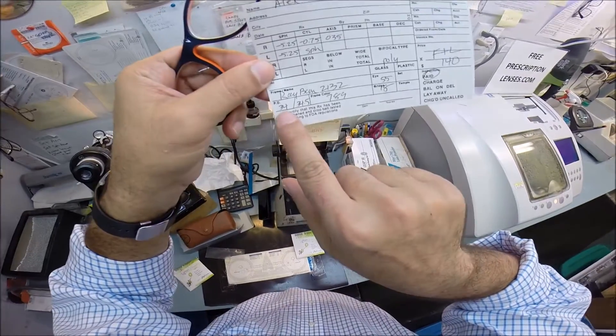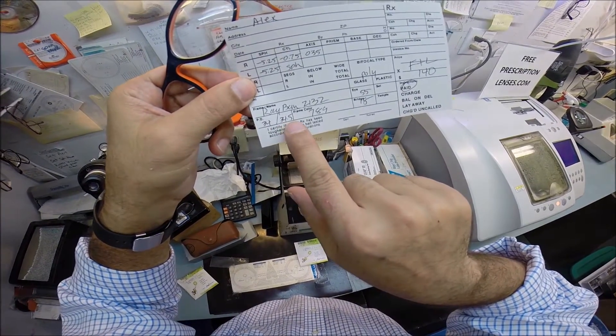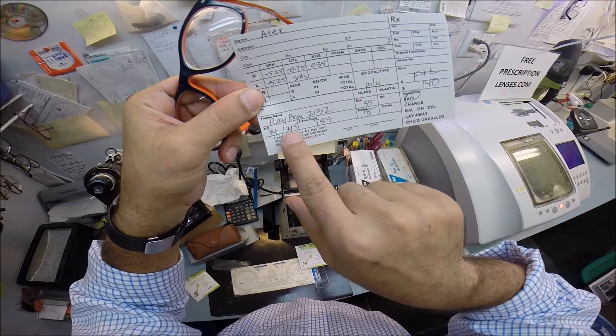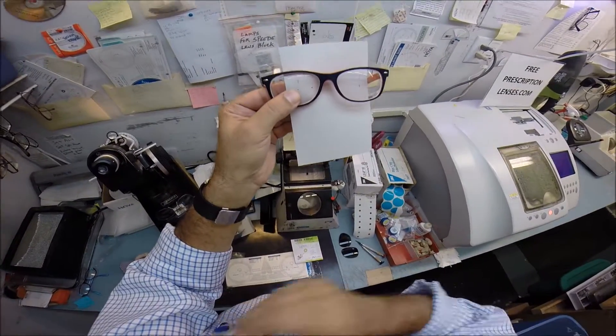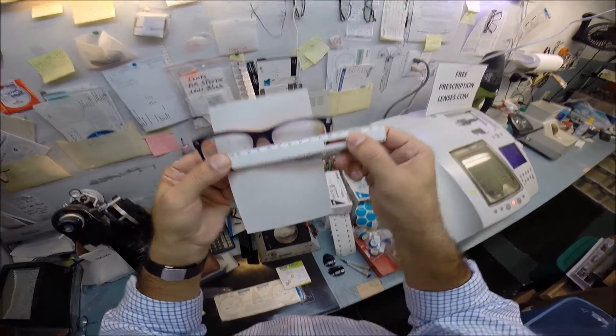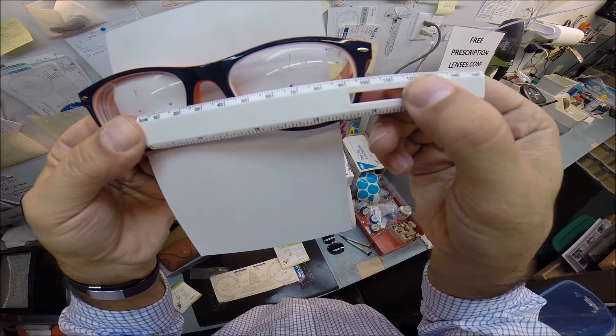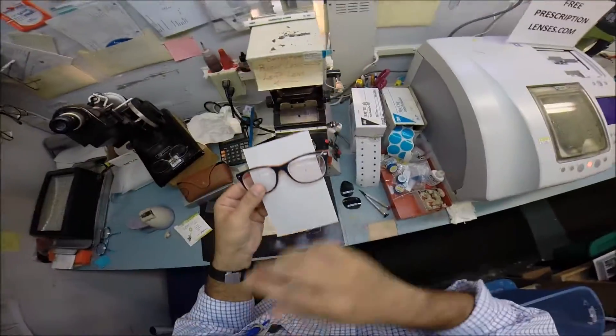Your pupillary distance is 34 for your right eye, 34.5 for the left, or a combined measurement of 68.5. I'm going to turn that over. I'm going to put my thumb on the right lens, on the zero. I'm going to hold it up to the left lens. We're getting 68.5. So, that is cut perfectly.